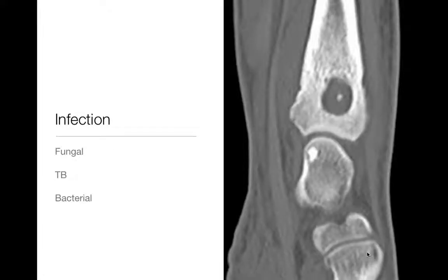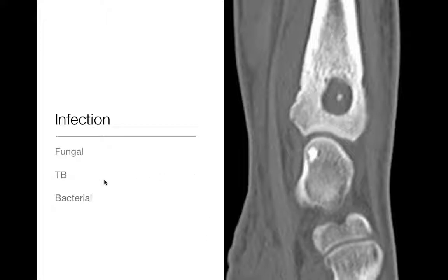Infection is on the list — specifically focal infection, Brody's abscess. Always think of infection when you see something that looks like a bone tumor, because infection can mimic many things: fungal infections, TB, bacteria. Here's a geographic lytic lesion with a central bony sequestrum, which is typical of a Brody's abscess, in the distal radius on CT scan. Brody's abscess for infection is on your differential.